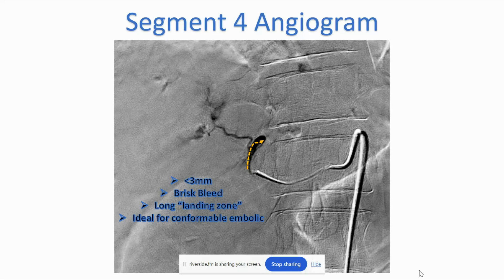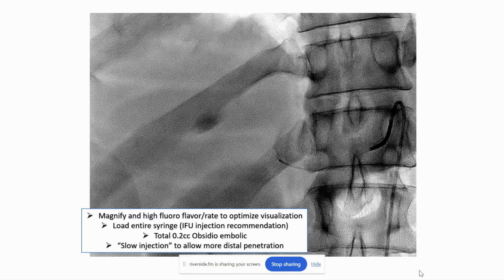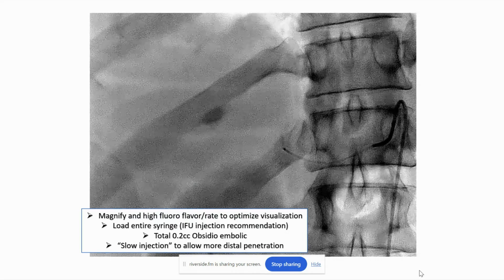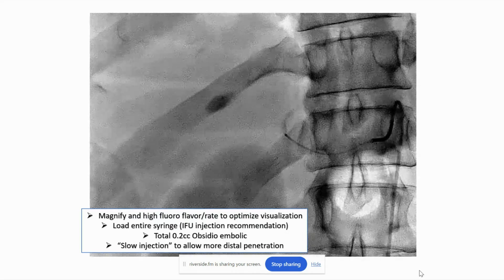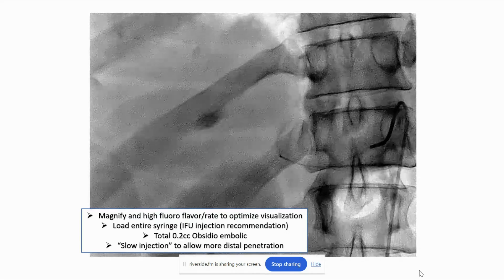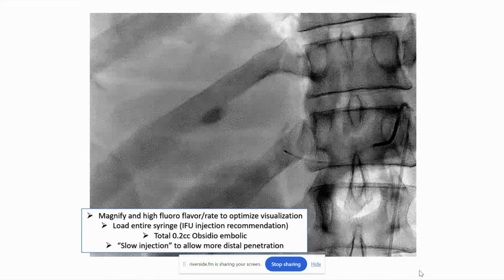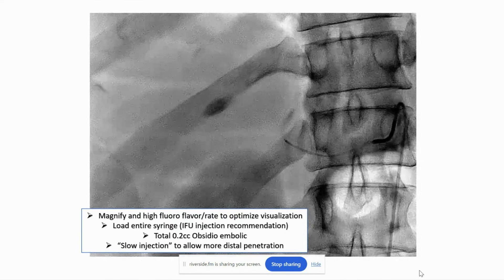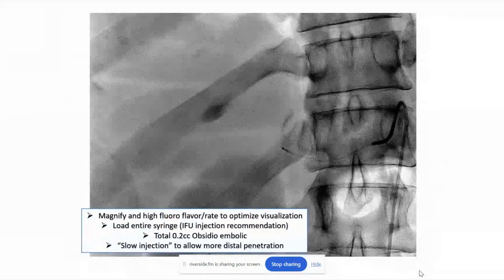This was a nice, ideal case for Obsidio, especially an early Obsidio case. This vessel is less than 3 millimeters. This is a brisk bleed, so I really want to get a durable occlusion, and I want to get it done fast. This is the fluoroscopy loop of the actual embolic going in.